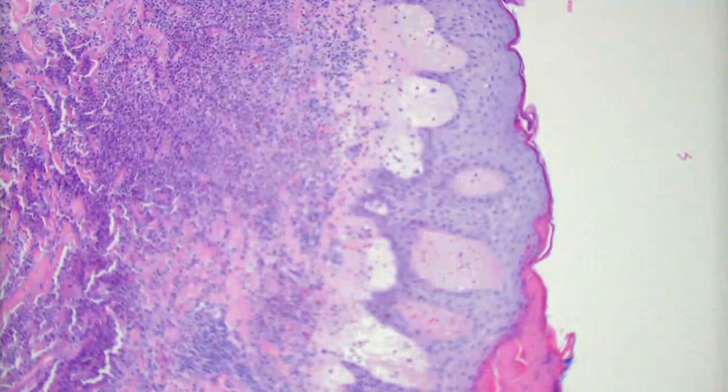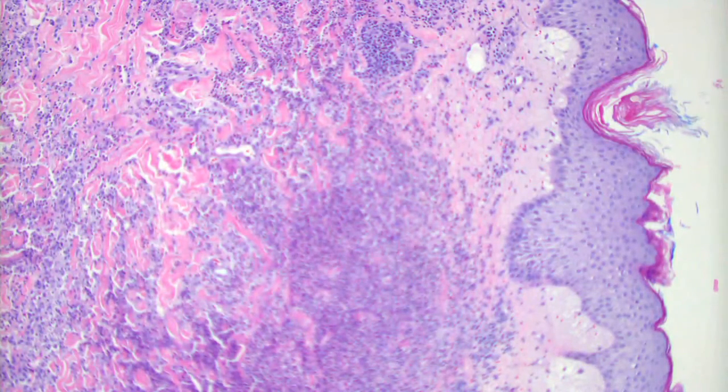Now what's in the differential diagnosis of this besides Sweet's? You have to think of early pustular PG. Good, pyoderma gangrenosum, absolutely could do this. That would be a clinical differential really at this point. For other neutrophilic dermatosis, infection. Good, you think of infectious processes. What else for neutrophilic?